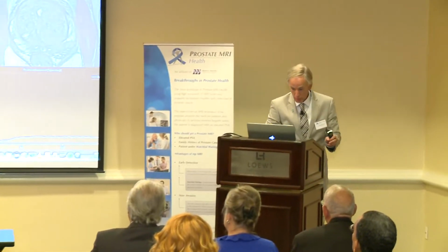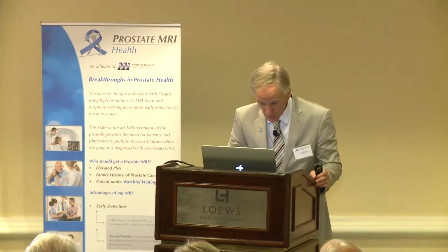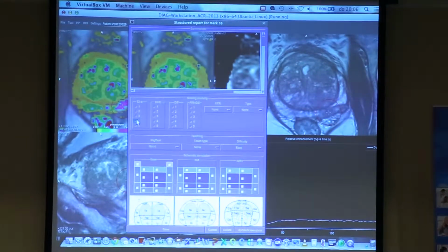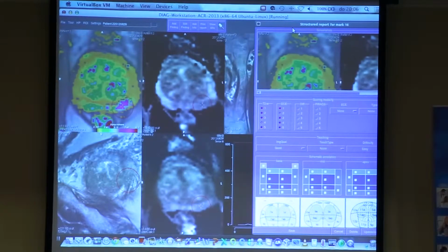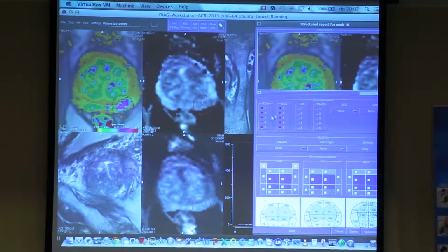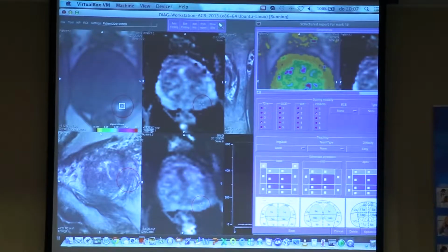Oh, you give it a 4. Okay, let's go. What's the ADC value? I'm not there yet, Joe. You're too fast. You're a non-academic radiologist. I take time. Okay. A 4. Contrast. Not much, isn't it? 2. And diffusion? What's diffusion? Okay. The ADC value, Joe, is 1248. It is not bright and it's not white. So forget it. That means 2? Yeah? Final score? 2.